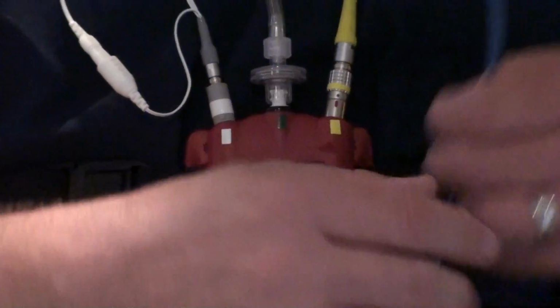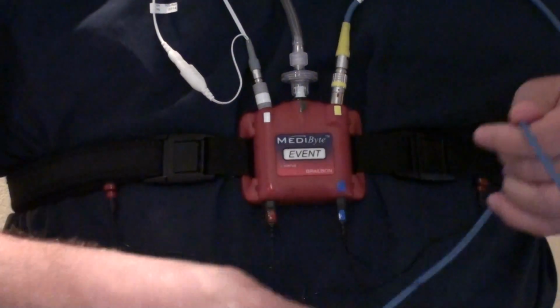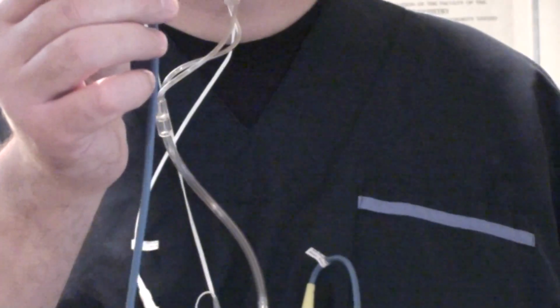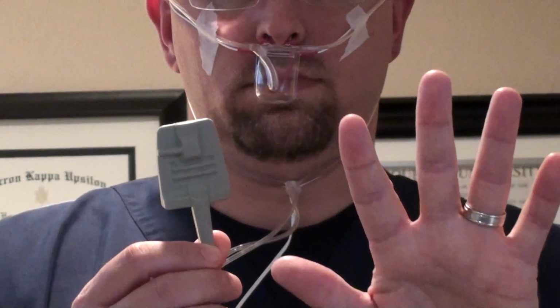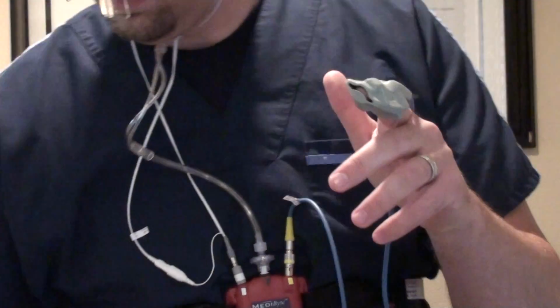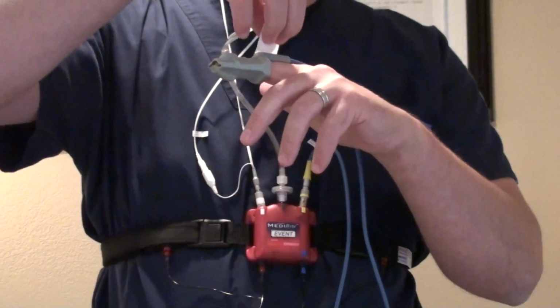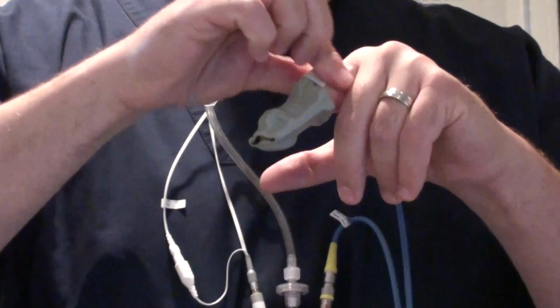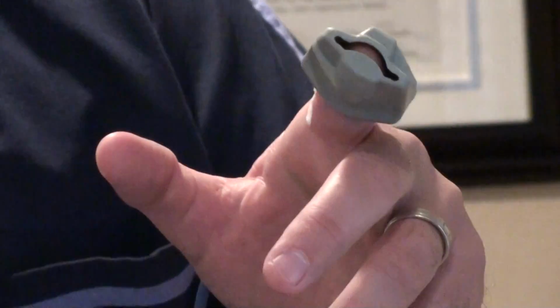Next, take the Spo2 sensor. This measures blood oxygen saturation and pulse. Be sure you remove all nail polish before putting on the Spo2 sensor. Place the index finger into the rubber sensor. Tape the sensor cable with the medical tape. Again, adding more medical tape will help to secure the sensor and avoid it coming off during the night.